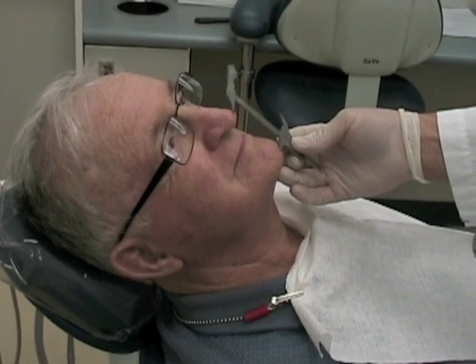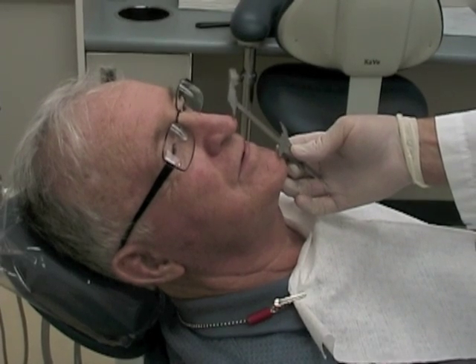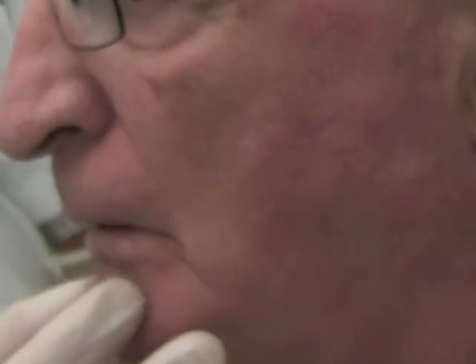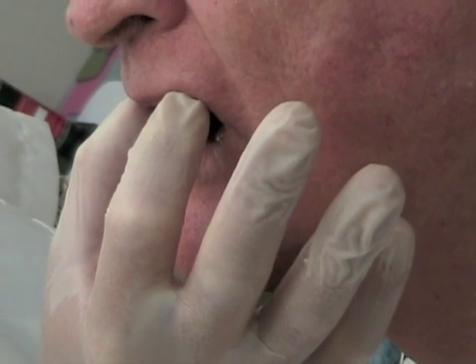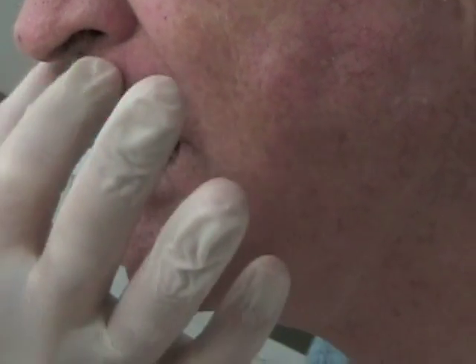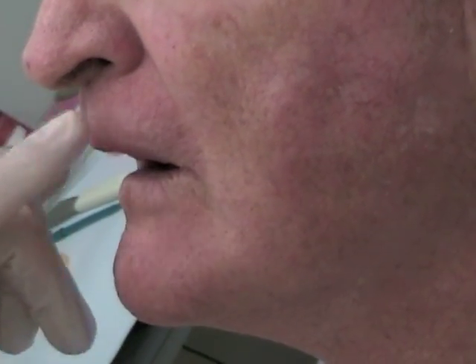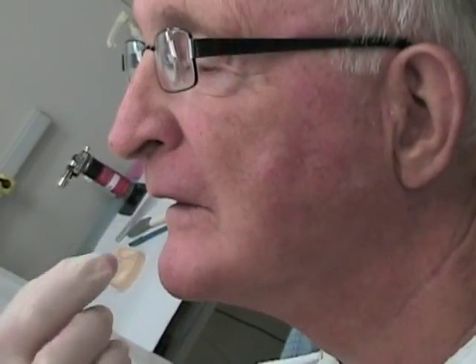For all measurements of occlusal vertical dimension, make sure the patient is not laying down — the patient should be upright. Insert the maxillary record base and wax rim and check for lip support in profile and also for the length of the incisal edge. This rim is a little bit too short and doesn't provide sufficient lip support, so we'll probably add some wax to both the facial and the occlusal surface.